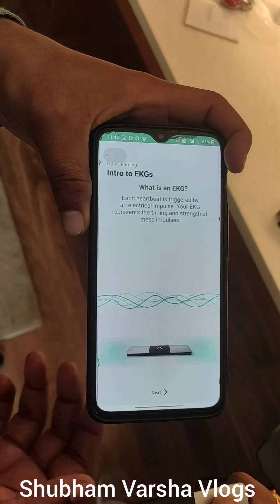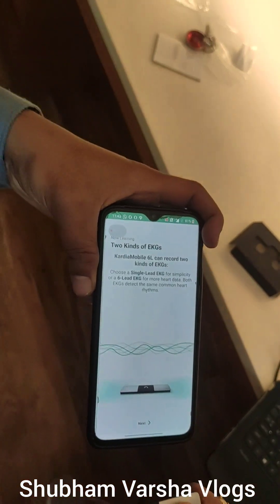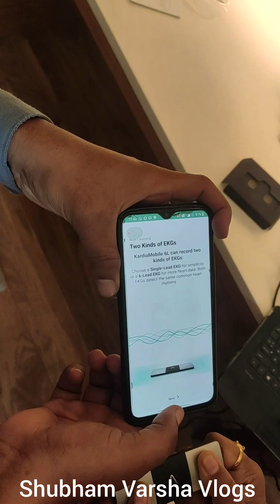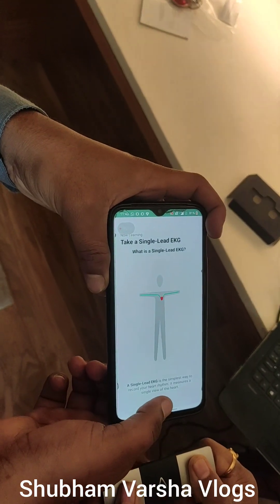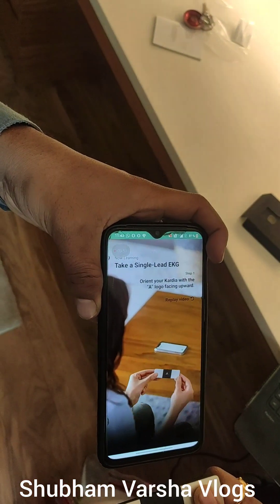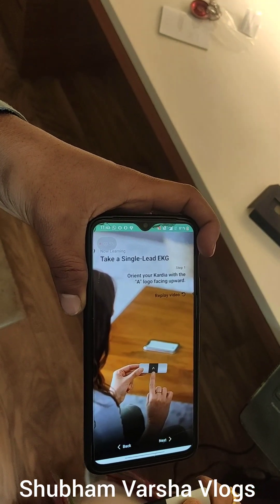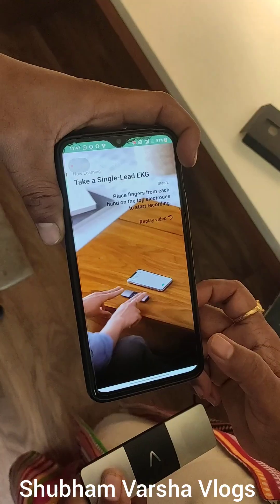You have to press your both thumbs on both sides of the AlliCore device, then press the next button. You will see they take a single lead ECG. You have to follow the instructions as given.